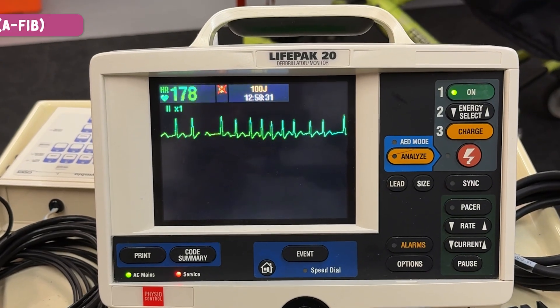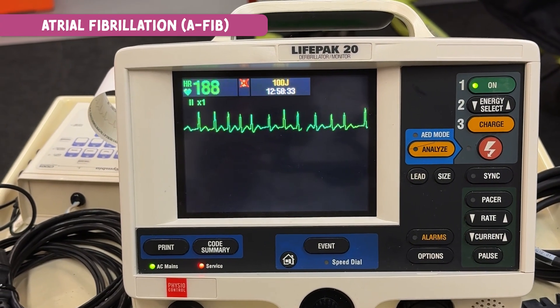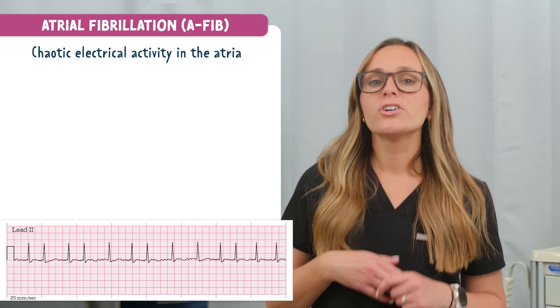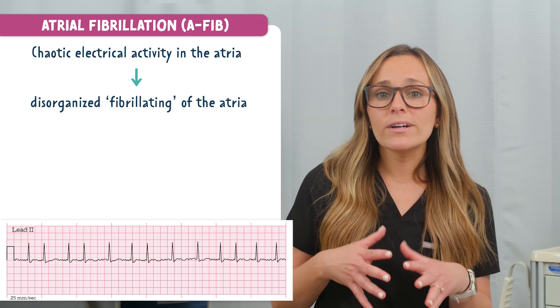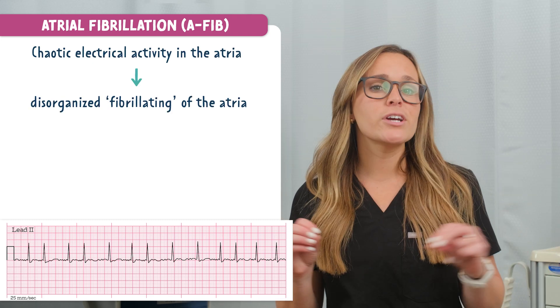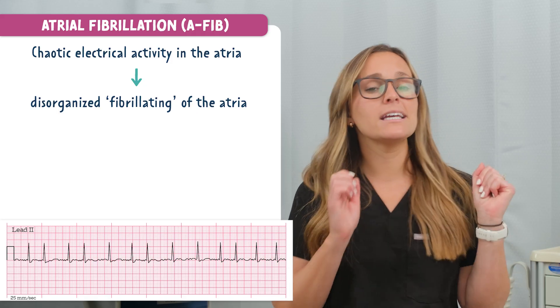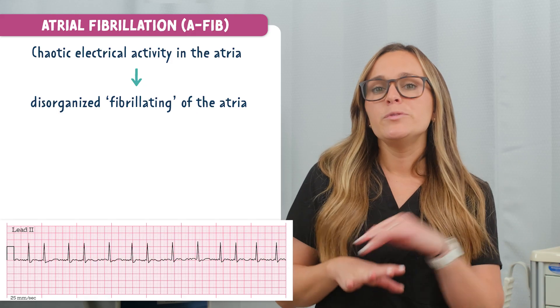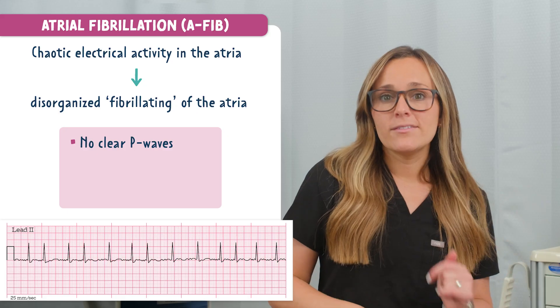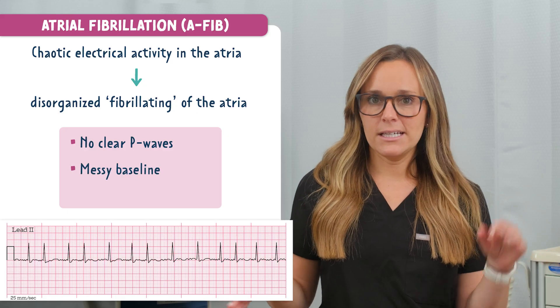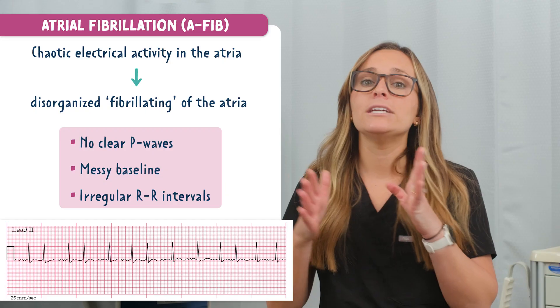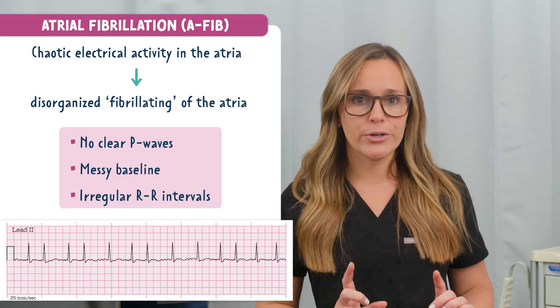If you guessed atrial fibrillation or AFib, you're right. AFib is caused by chaotic electrical activity in the atria, causing disorganized fibrillating of the atria, which is why you'll see the classic irregularly irregular rhythm. In AFib, you won't see any clear P waves and the baseline looks messy. The R to R intervals are inconsistent and irregular, which is a major clue.